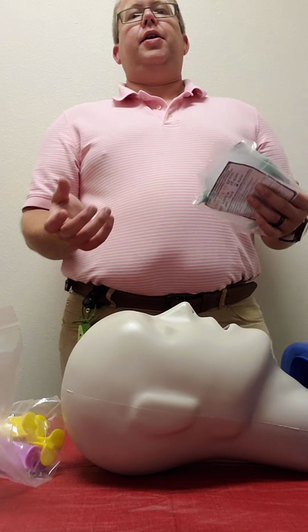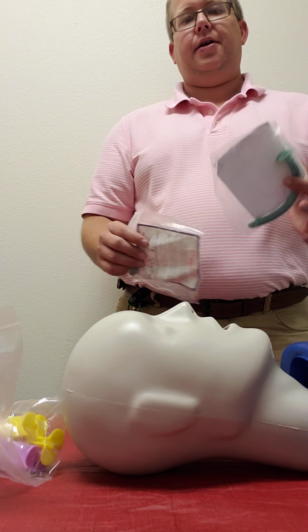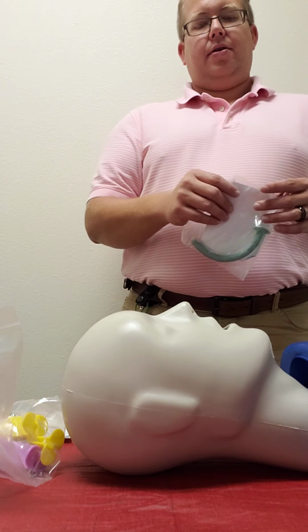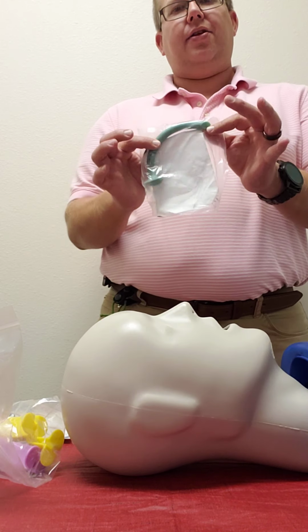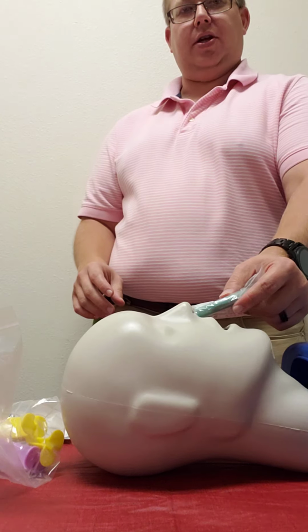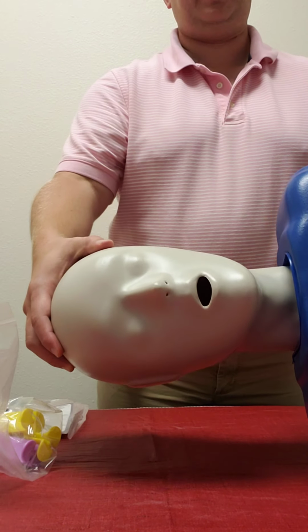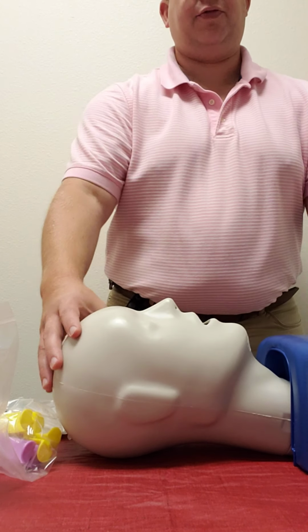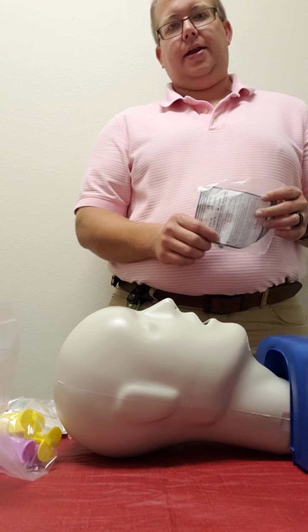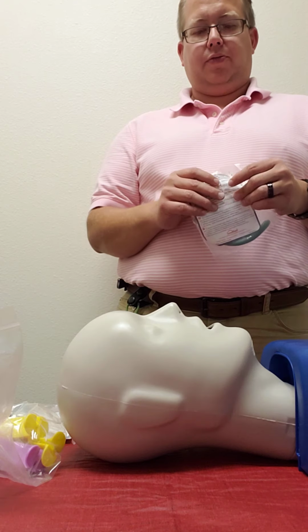So you've determined that your patient has a gag reflex. So we want to put in an NPA. You want to select the right size. You select the right size by looking at the tube. Is this tube going to fit in this patient's nose comfortably? Obviously, in Manny over here, Manny has two tiny nostrils that we do not have NPAs for. So we will not be sticking an NPA in his nose. But I will show you what to do.